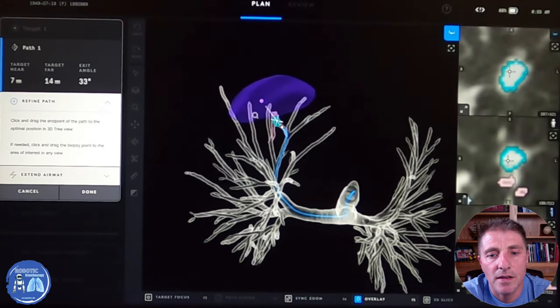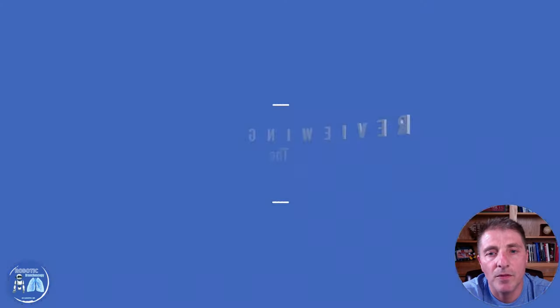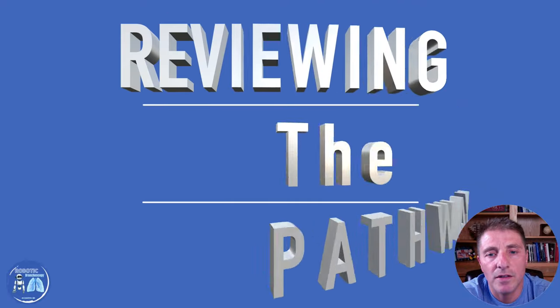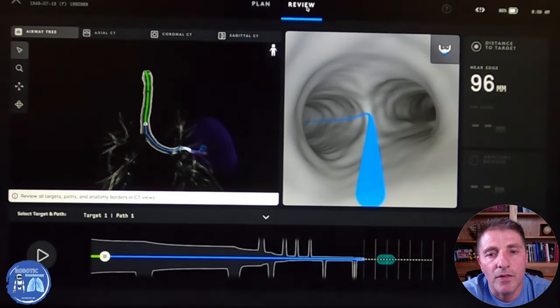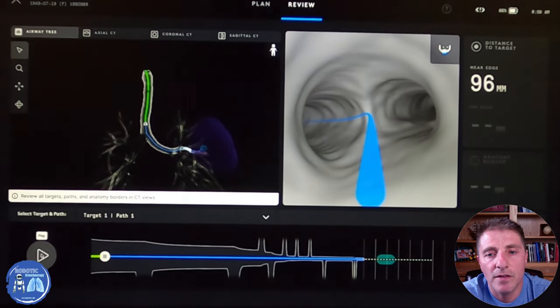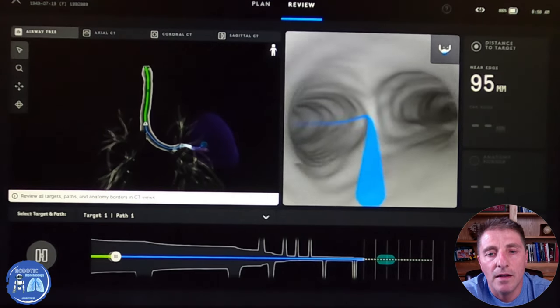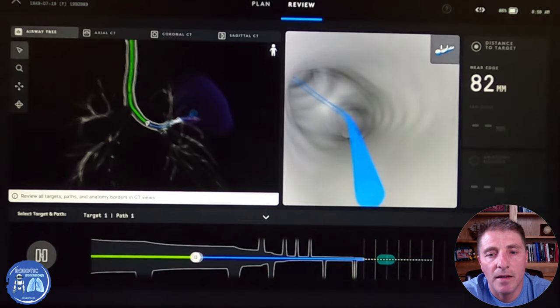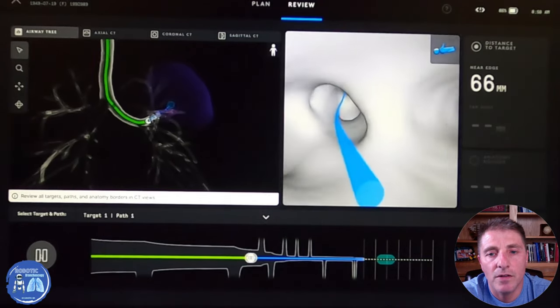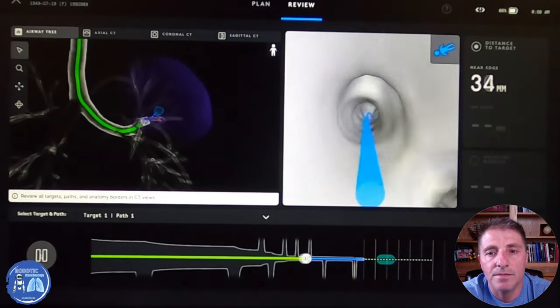As you see, the computer also gives us a purple border to let us know where the pleura is, which is the border of the lung wall. Before the procedure, we review the pathway in a 3D virtual model extracted from the CT scan, and we can make a virtual drive through the airway to the target.